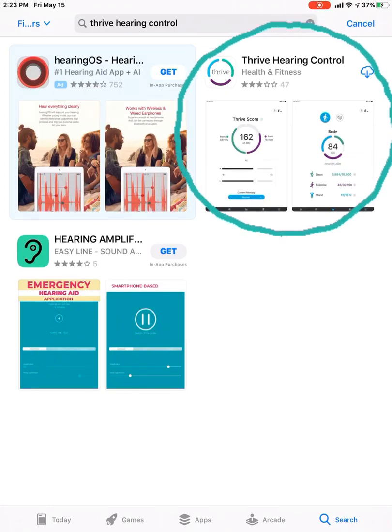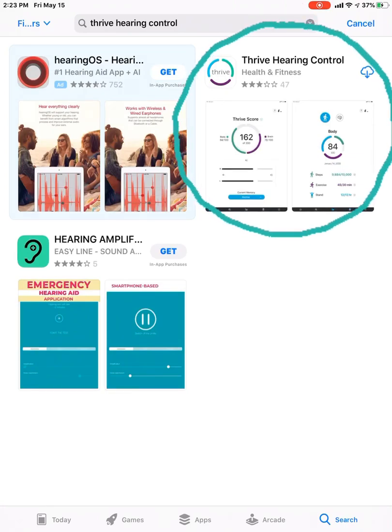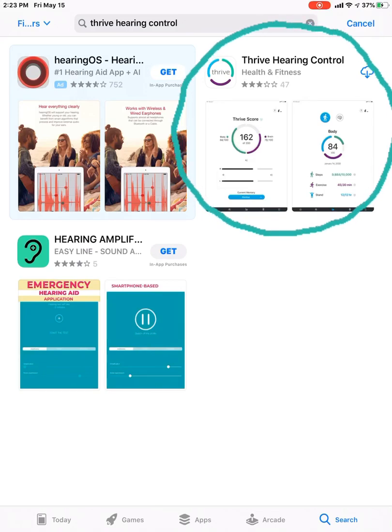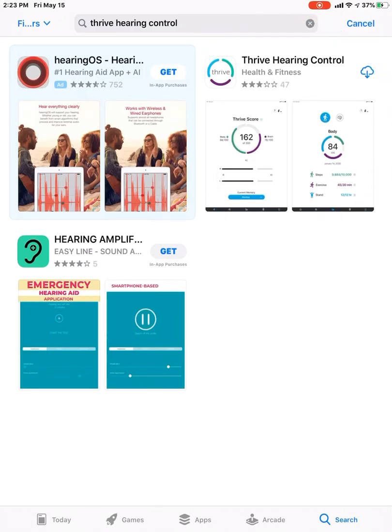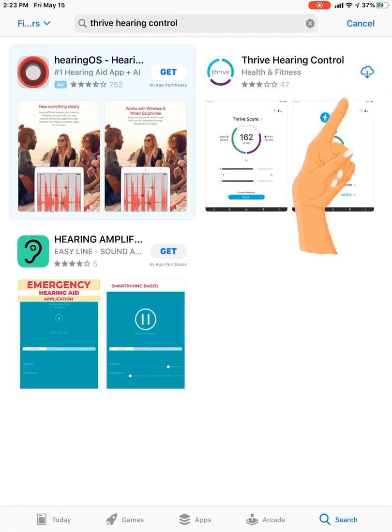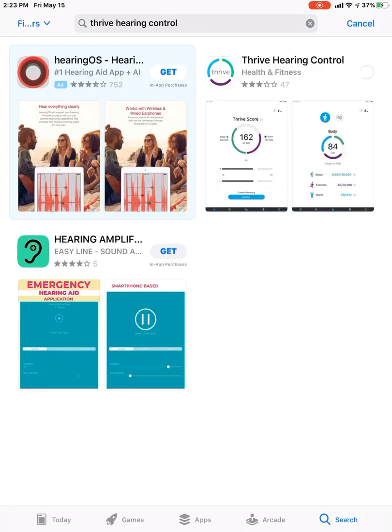And you'll see on the right hand side, it says Thrive hearing control. And I'm just going to tap that little cloud. And it's that little cloud right now because I've already downloaded this app and I'm re-downloading it. If you're brand new to this app, you'll see it may say get. So you will tap either the sign that says get or the little cloud if you've had the app before in the past.